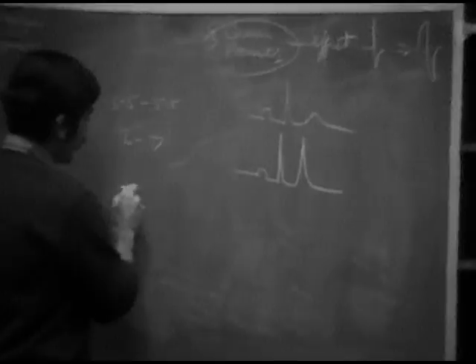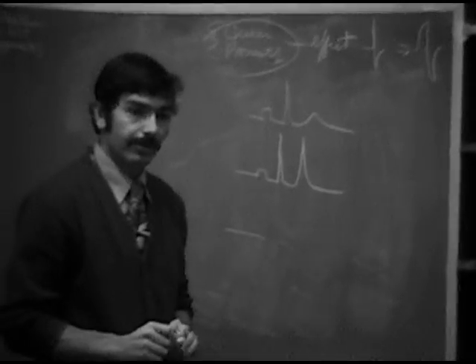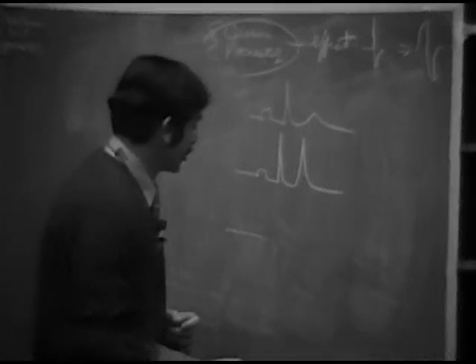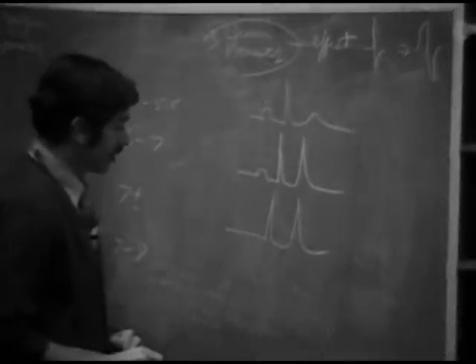And then as the potassium goes up, the P wave will diminish in amplitude, although the P waves will still be atrial contraction, but you'll lose the amplitude of the P wave. It may look like you're dealing with a nodal rhythm. And the T wave will still remain peaked. And then finally, when you get up in the range of 7 to 8, what do you see in the electrocardiogram?